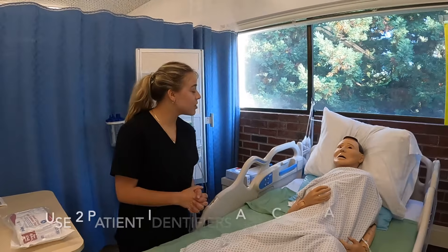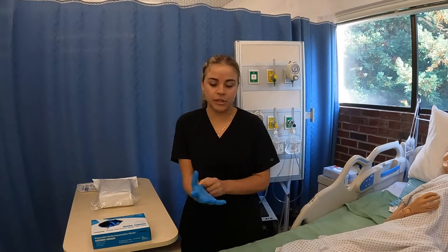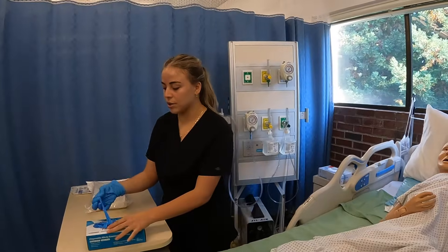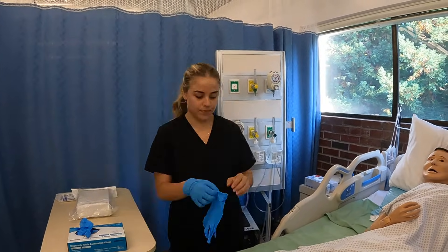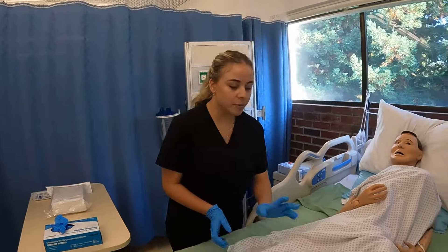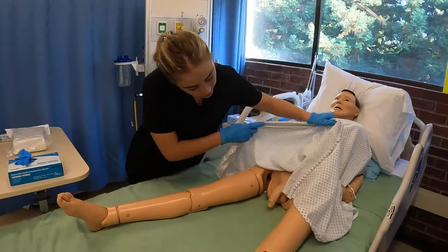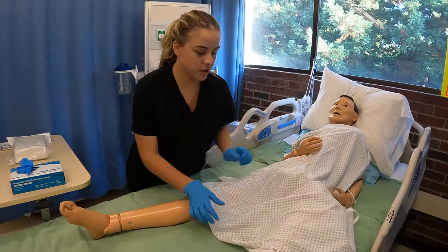Hi Hector, I'm Nurse Samantha, and we're going to be inserting a Foley catheter into you. So after explaining the procedure to the patient and verifying the orders, now we just want to assess the area, making sure that it's clean. I'm just going to lift up your gown. All right, it looks good, so we're ready to start.